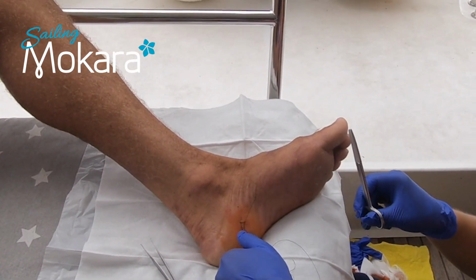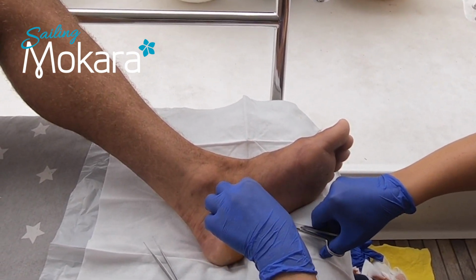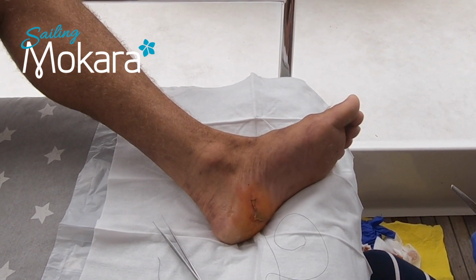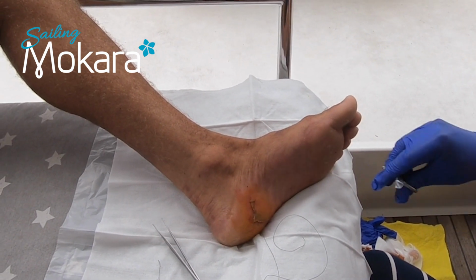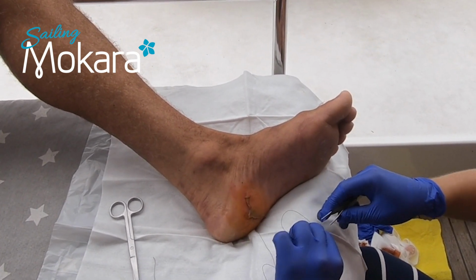So you do one at a time. You don't do it like sewing. No. One by one. And you leave it like this because later, when you have to remove them, it mustn't be too tight, because then you can't cut them out.